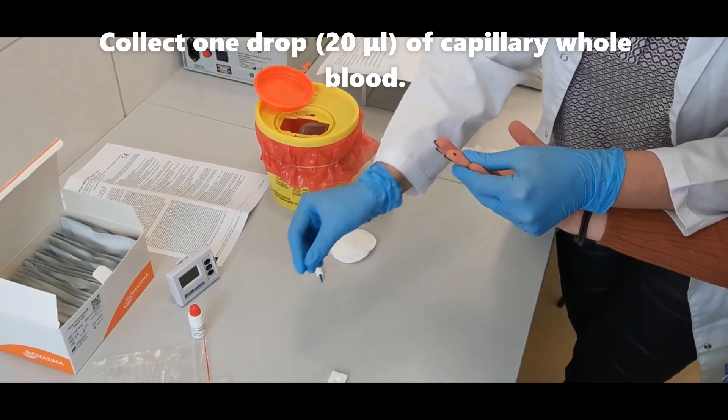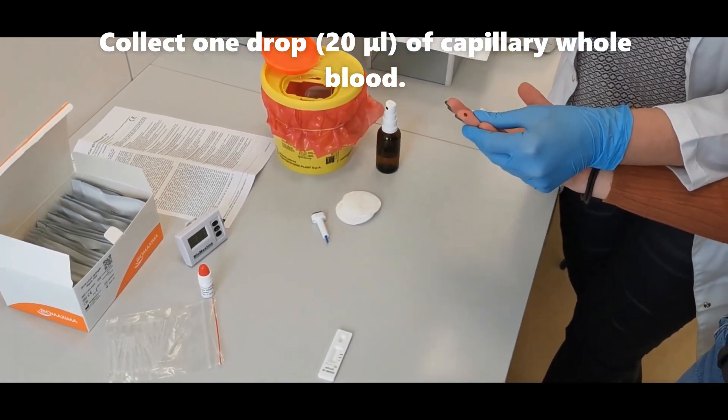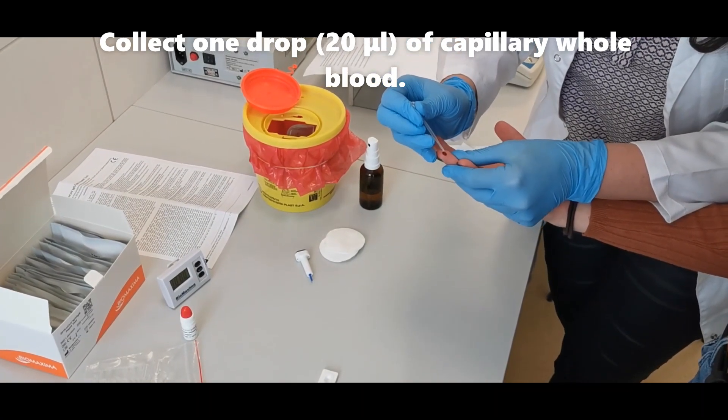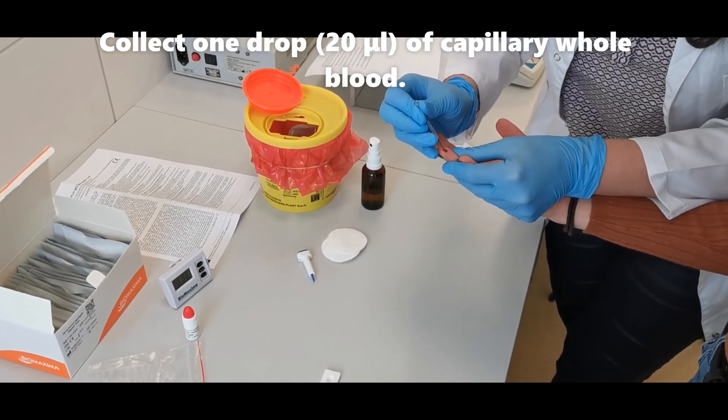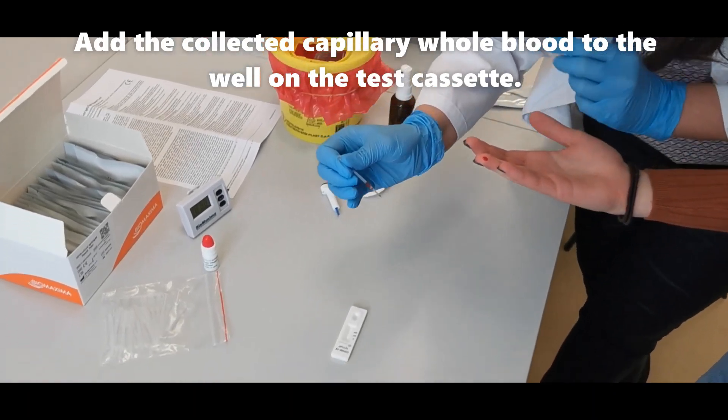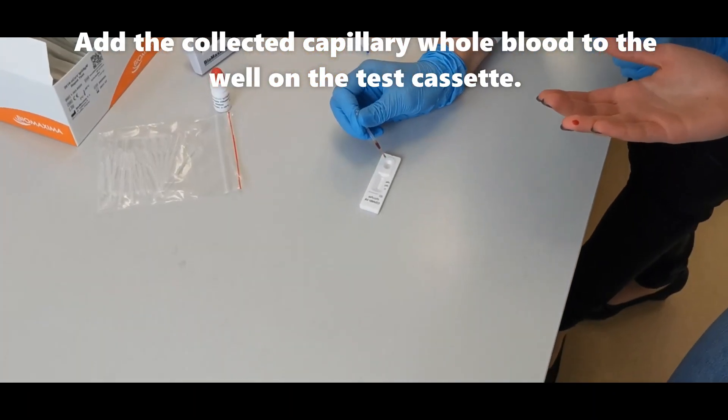Collect one drop, about 20 microliters, of capillary whole blood. Add the collected capillary whole blood to the well on the test cassette.